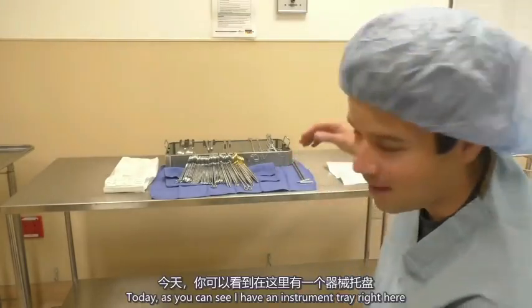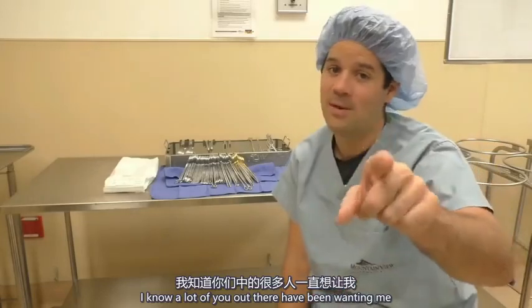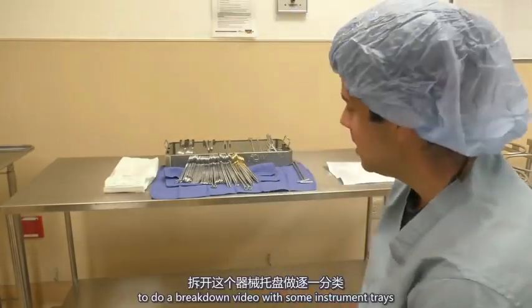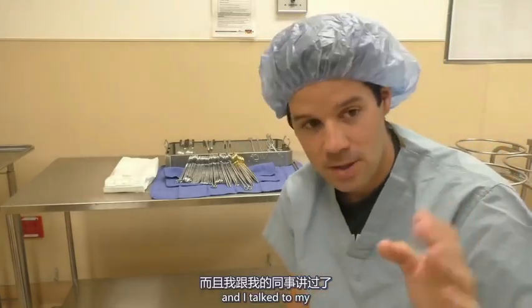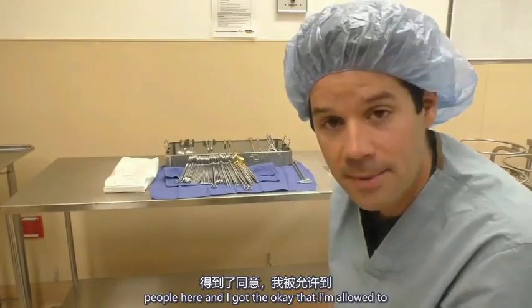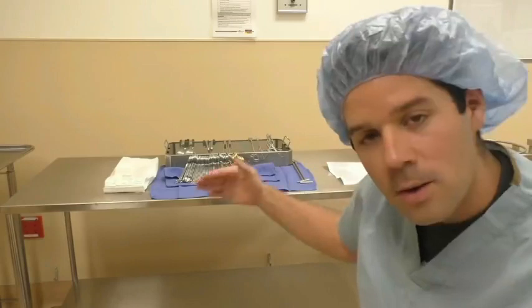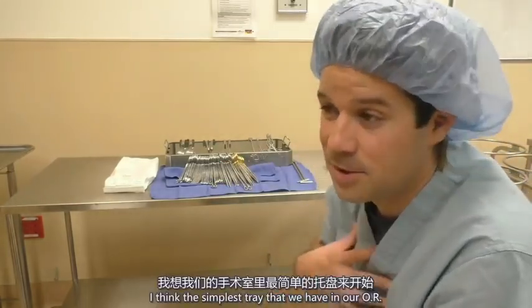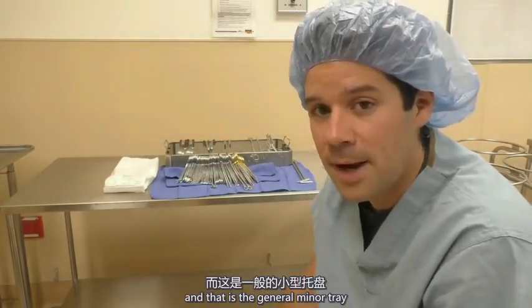Today, as you can see, I have an instrument tray right here, and we're going to be breaking it down. I know a lot of you out there have been wanting me to do a breakdown video of some instrument trays, and I think it's a great idea. And I talked to my people here, and I got the okay that I'm allowed to open up a tray and talk about it. So, we're starting with, I think, the simplest tray that we have in the OR, and that is the general minor tray.